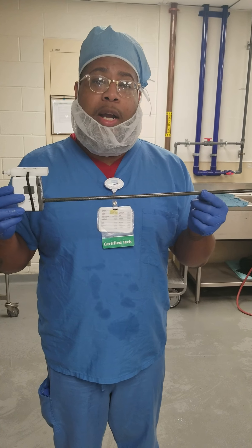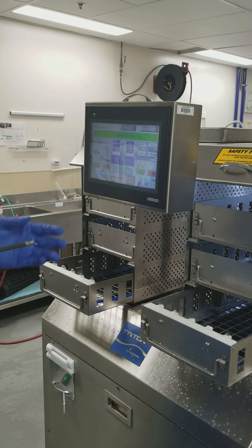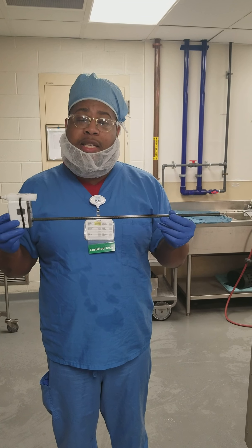This is a DaVinci XI wand and this is the Triton 72. I'm going to show you today how to hook up a DaVinci wand to the XI cycle on the Triton 72.